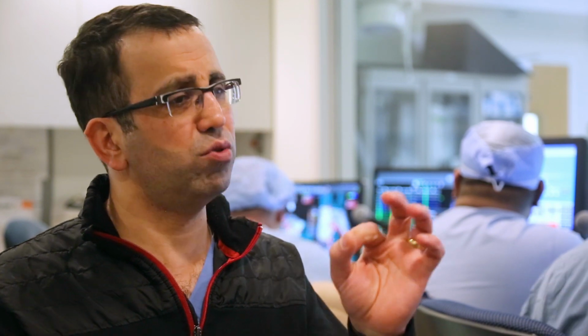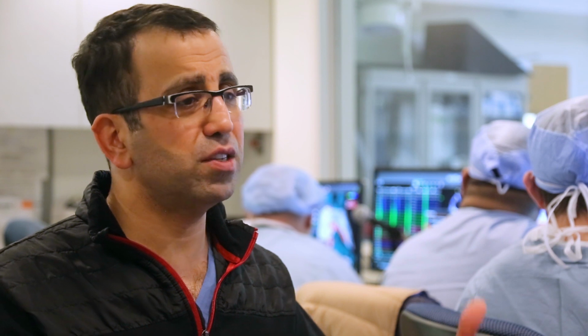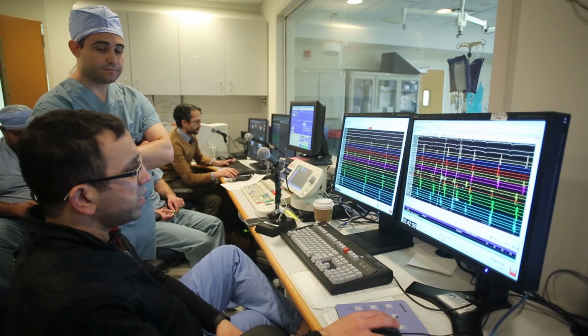This area, still on isoproterenol infusion, we're going to ablate this area, and we're going to create probably quarter-size lesions, 6-7 lesions in the same area of this trigger. And we're going to shock the heart again to sinus rhythm. And if that area was the area responsible for AFib, AF is not going to reoccur. So that validates the two things. It validates that that was indeed a trigger, and that ablation in this area removed this trigger. Once you have a trigger, it's many times going to be reproducible.